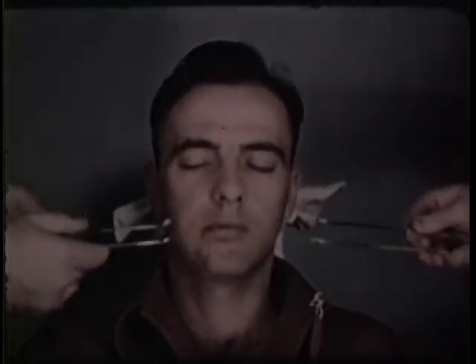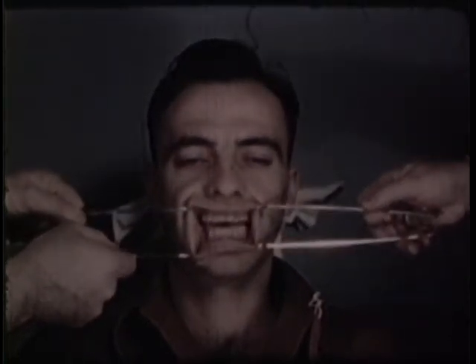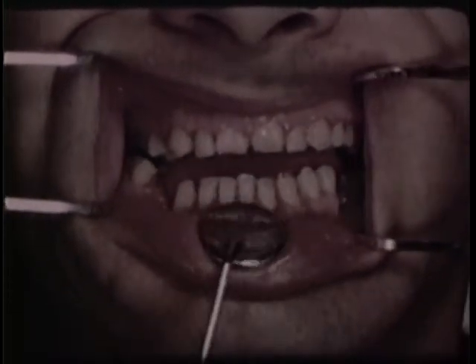This 26-year-old soldier was shot in the right side of the face in action at Luzon. The facial injury included a comminuted, compound fracture of the mandible in the mental foramen region, right side, with considerable fragmentation of the bone. As a result, the two bone ends have failed to unite. Though the wound is healed, additional bone is required to bridge the gap and restore the contour of the mandible. Occlusion is poor, and there is marked mobility at the site of fracture.